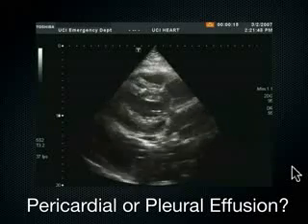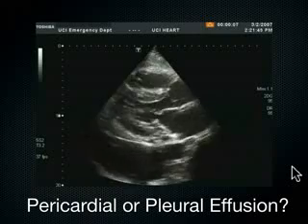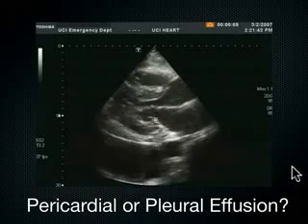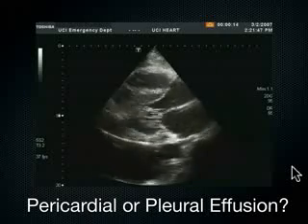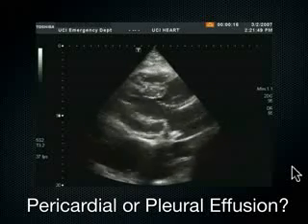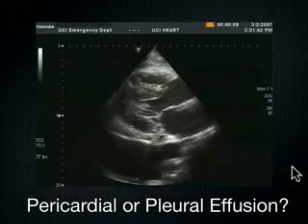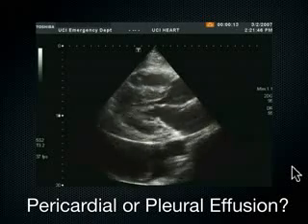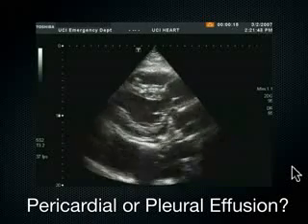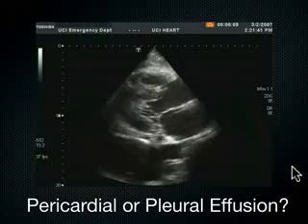Simple. I go into my FAST exam window, looking at the spleen and the diaphragm. I look superior to the diaphragm, and if I don't see the mirror image artifact of the spleen up in the chest, if I see all this black stuff on top of the diaphragm, looking coronally, laterally with the P21 probe, then I know, with the same probe I'm using for this, that this confirms to me that this is pleural. I always do that.